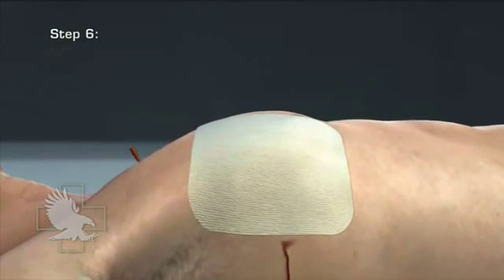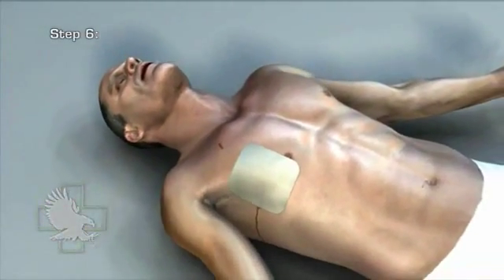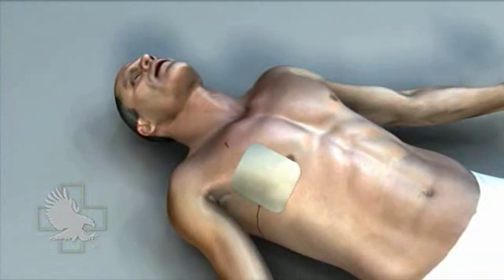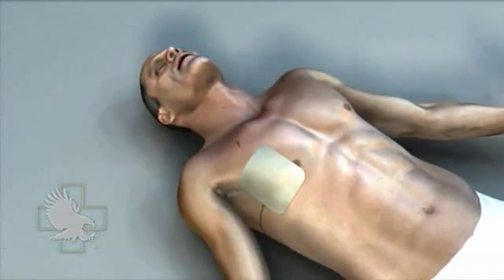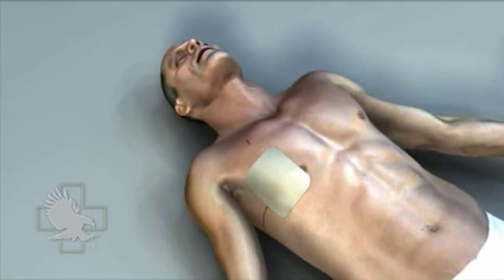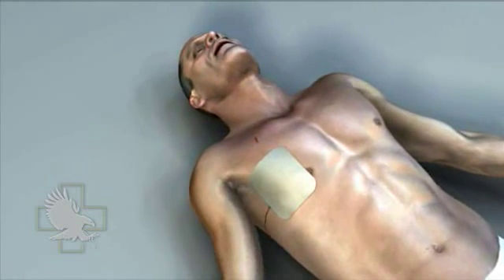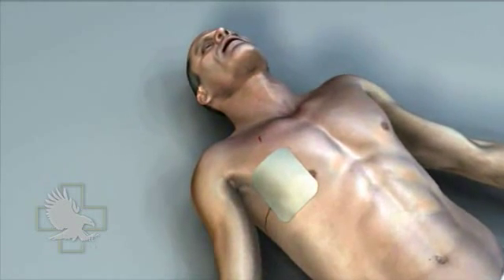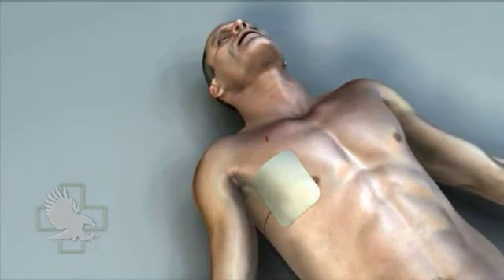There is no need to create a flutter valve or attach a three-way stopcock for this catheter. Remember to periodically reevaluate the casualty. If progressive respiratory distress redevelops, assume that the catheter is no longer effectively ventilating the pneumothorax. The rescuer may either attempt to flush the catheter with sterile saline or other sterile IV solution, or repeat the procedure with another ARS placed adjacent to the first ARS.